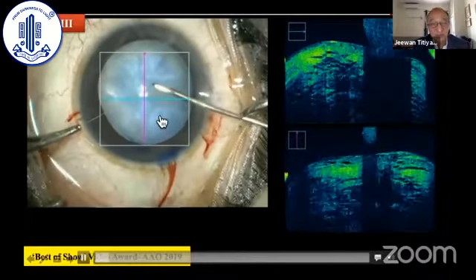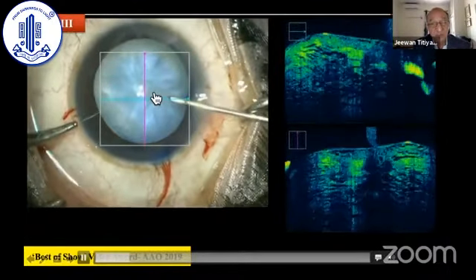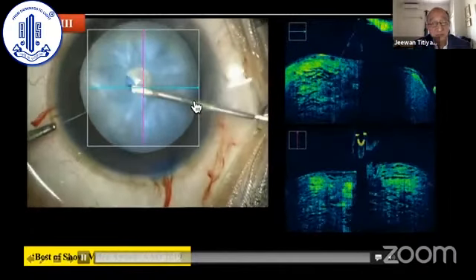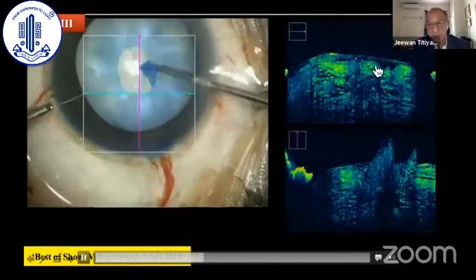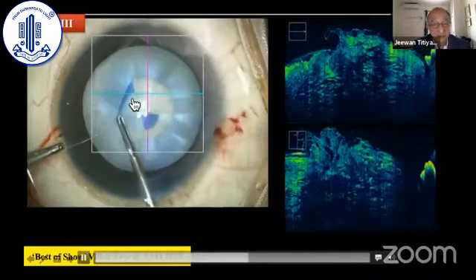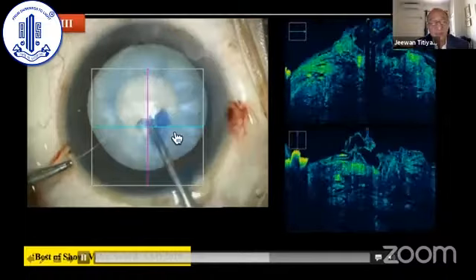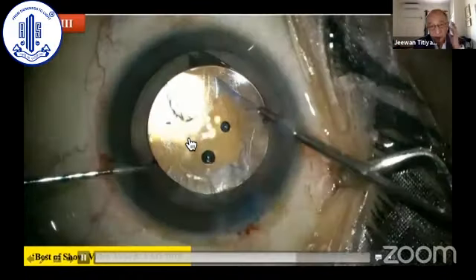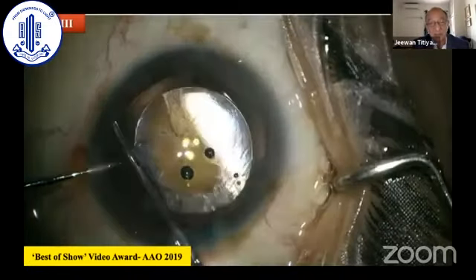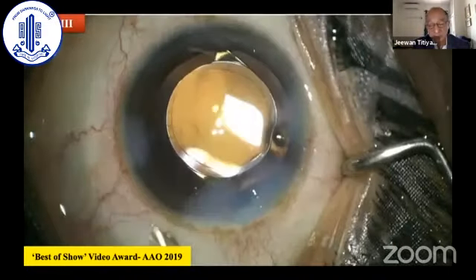If you see this video here, you can have a thick oily type of fluid coming out, and with a gentle pressure in the side port, you can release the pressure and flatten the entire anterior capsule, and you can complete the rhexis and can assess your pressure and do a spiraling technique, get to a size where phaco can be easily done, and subsequently after completion, you can implant the IOL and you can redesign, refashion your capsular rhexis size as per the requirement of these cases.